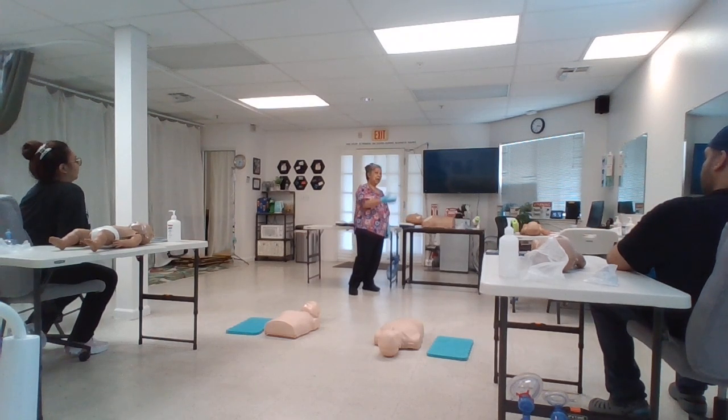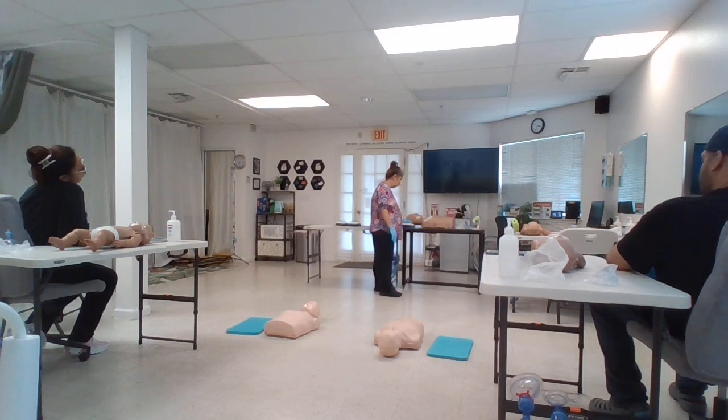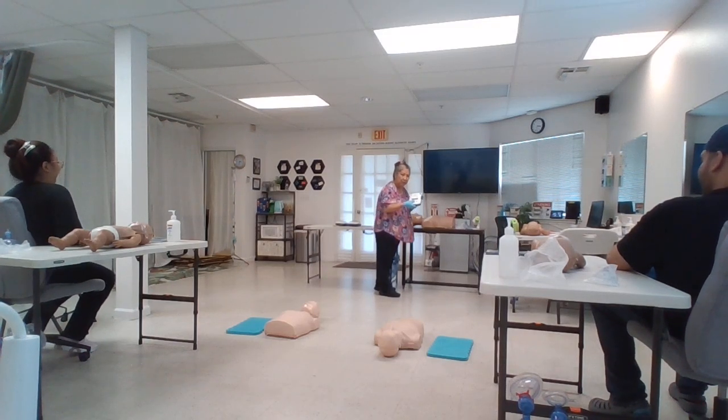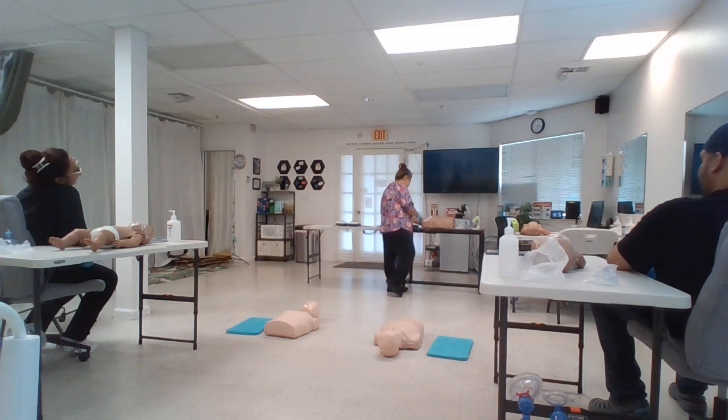Shock delivered. Then you begin CPR. And to turn this off, you need to push this button a lot longer than when you turn it on, so about a second. So press hard. Okay.